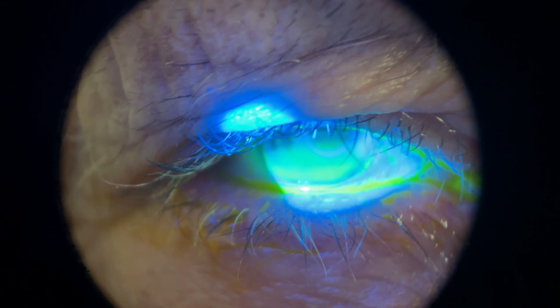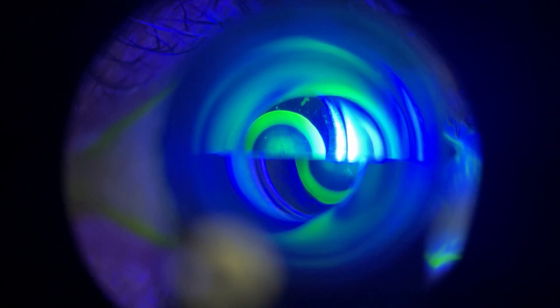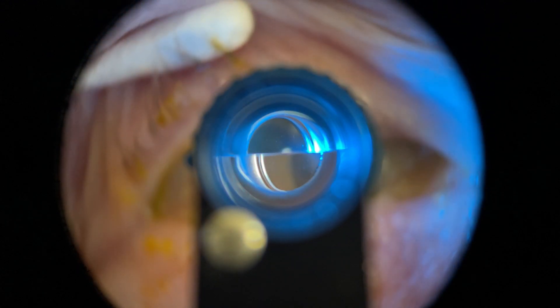Once you're happy with your settings, look back at the patient's eye and check whether it's full of tears. If that's the case, dry them off because it's going to give you a bad measurement. If your patient is squinting or blinking too much, you can use a Q-tip or your fingers to open the lids. But please be very careful not to push on the globe, as this is going to falsify your measurements.